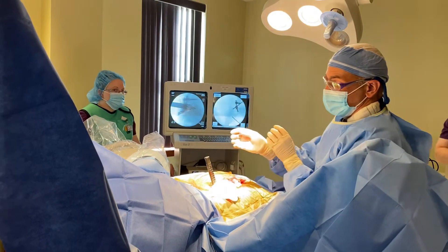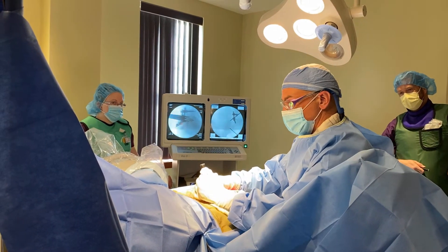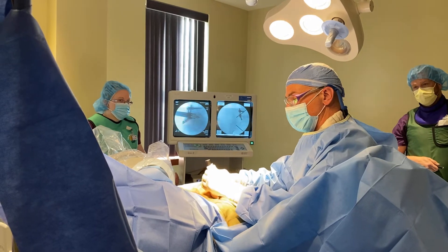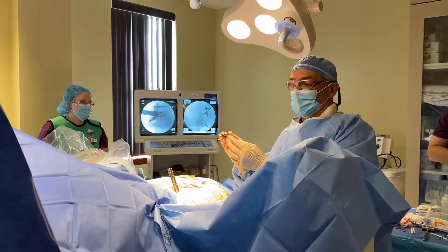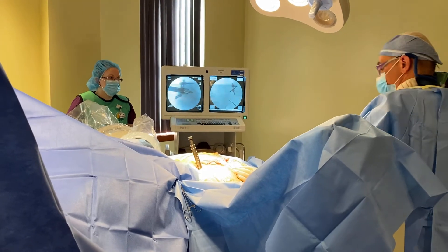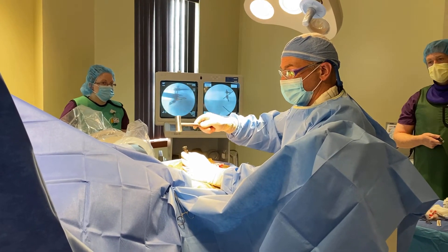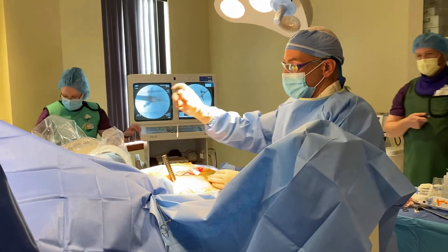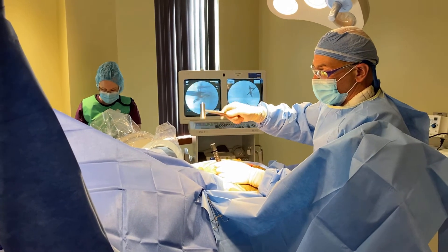We remove the plunger. Now we have the cortical graft on the introducer — we line everything up and tap it down into the joint where we made the drilling. We didn't broach, but this bone is hard enough that it will make its own opening. Now it's all the way down and we'll plunge that graft right off the tip with a couple of taps. That's basically it.